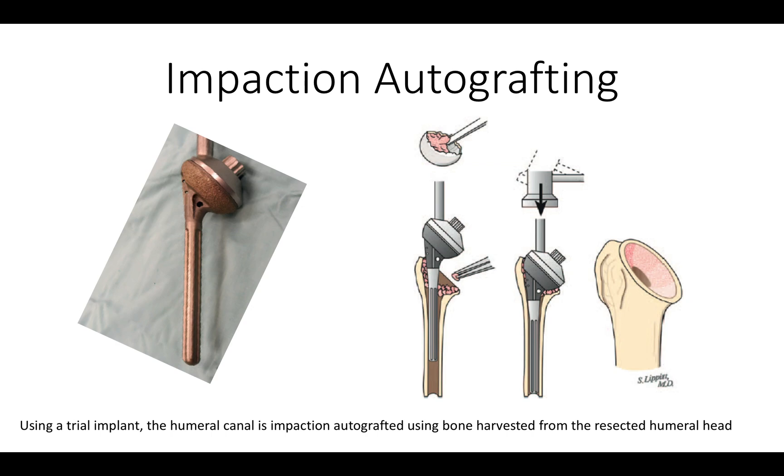We use impaction autografting, using this trial prosthesis as an impactor. We use autograft from the humeral head when it's available and impact that into the metaphysis and diaphysis until there's a tight fit.